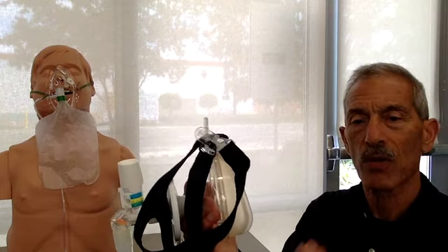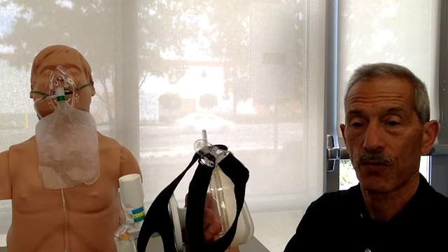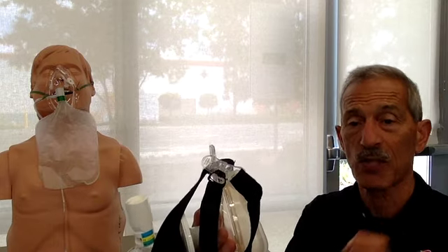It's really important that we coach them through this process, because it is rather frightening. They are short of breath, and it's almost like initially it feels like they're being suffocated. Now, there are some drawbacks to this, and I've seen this in the field a few times. You've got to be really careful with these patients. If you think about Bob right here, Bob's been short of breath 3 or 4 hours. He's been having accessory muscle use. He's kind of tired. He's actually wearing himself out from breathing so hard and for so long.